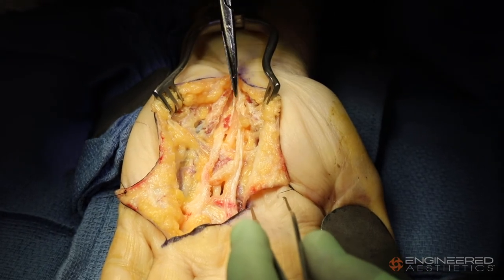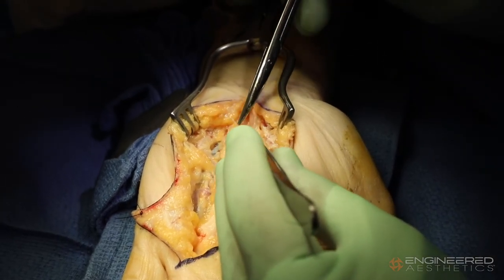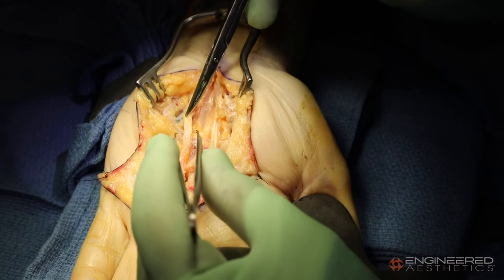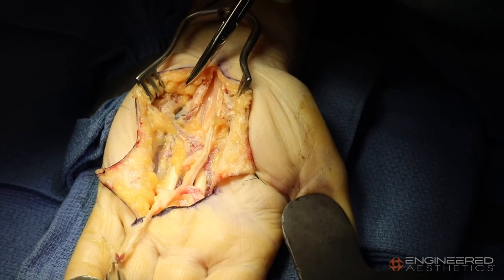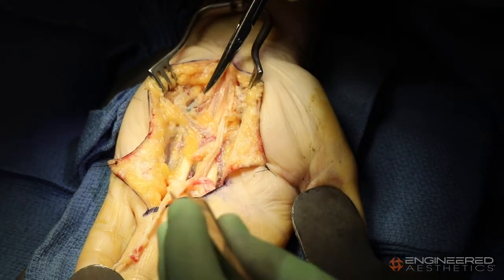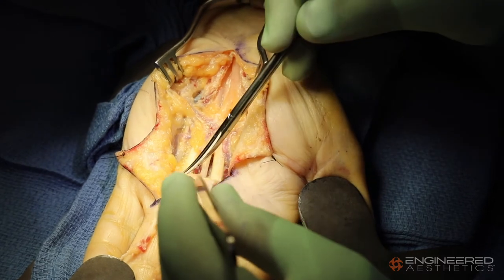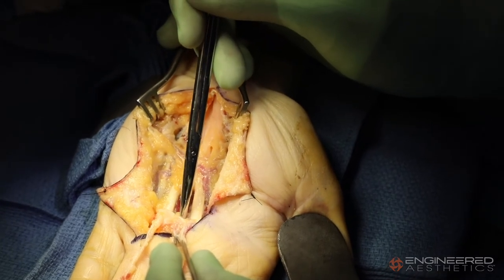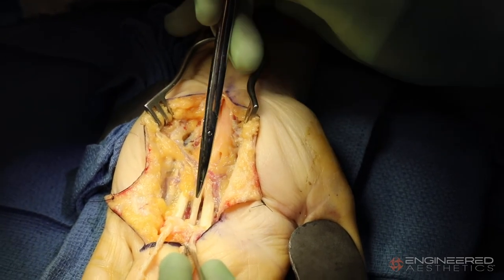I've released Guyon's Canal, I've released the carpal tunnel, I've freed the median nerve from the surrounding tissue, and now I've started my dissection for the Dupuytren's contracture release. This is the actual cord. It looks like nice linear fibers proximally, but as we go distally it starts to become a little bit more disorganized. As I separate that tissue from the underlying flexor tendon sheath, we're liberating the finger of this restrictive cord. I've done that for both the ring finger and the middle finger. You can see some thickening of that cord — it's not the thickest I've seen, but it certainly is restrictive. It's also important to point out the intimate relationship between that cord and the underlying neurovascular bundle.